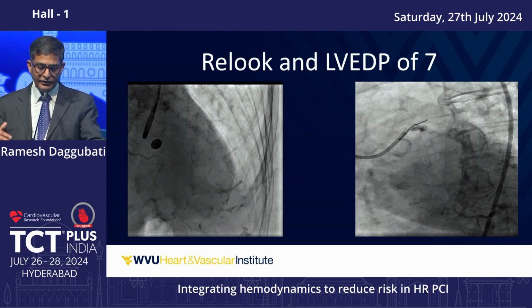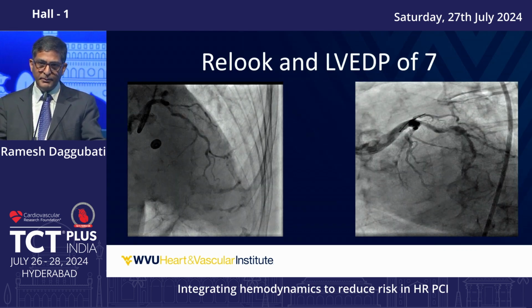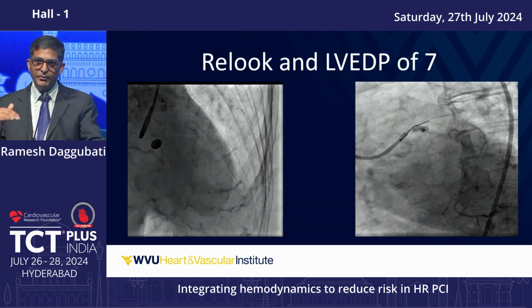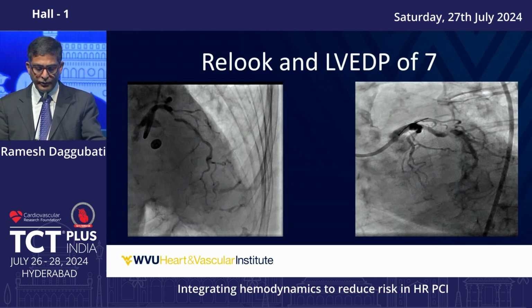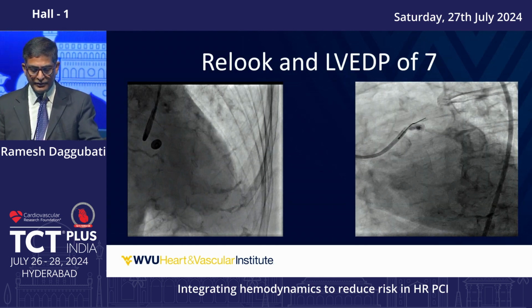And if I get into trouble with this patient, the only escalation could be balloon pump or, after balloon pump, ECMO. Whereas if you are in the Impella arm, you can go from Impella to a CP to a 5.5. Okay, so we can't cross over. We have to be careful about that as well.